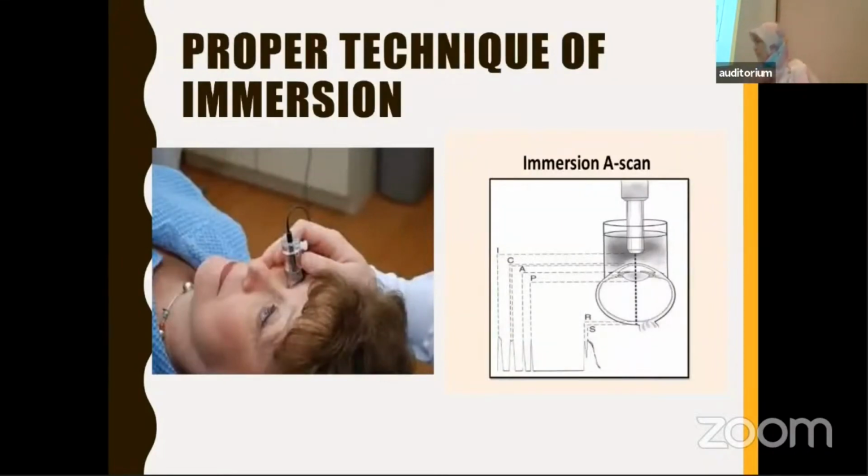You can all watch a proper video on the internet because we don't have much time to play the video here. This is the transparent shell here. We call it the Prager shell.